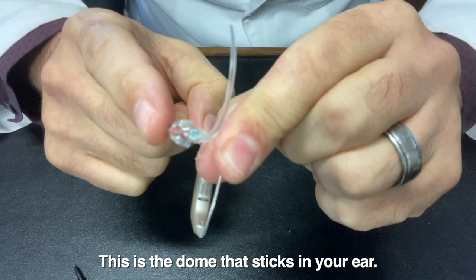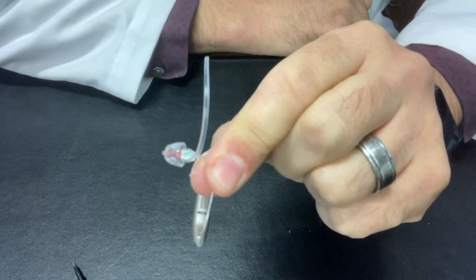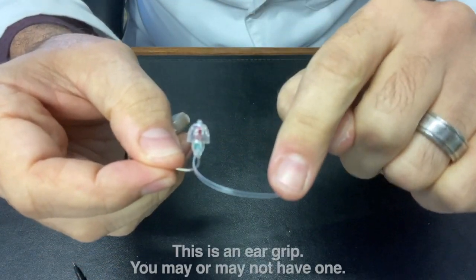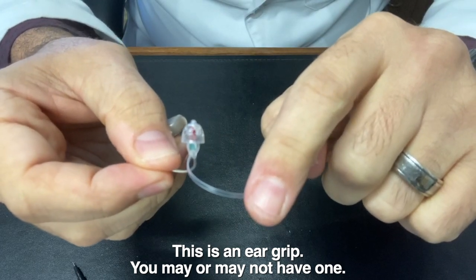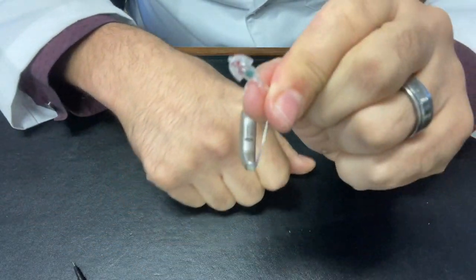This is the dome, this part here, the little part on the end that sticks into your ear, and we're going to go ahead and remove that. First of all, this ear grip may or may not be on your device. If it is, you can just kind of pull that out of the way.